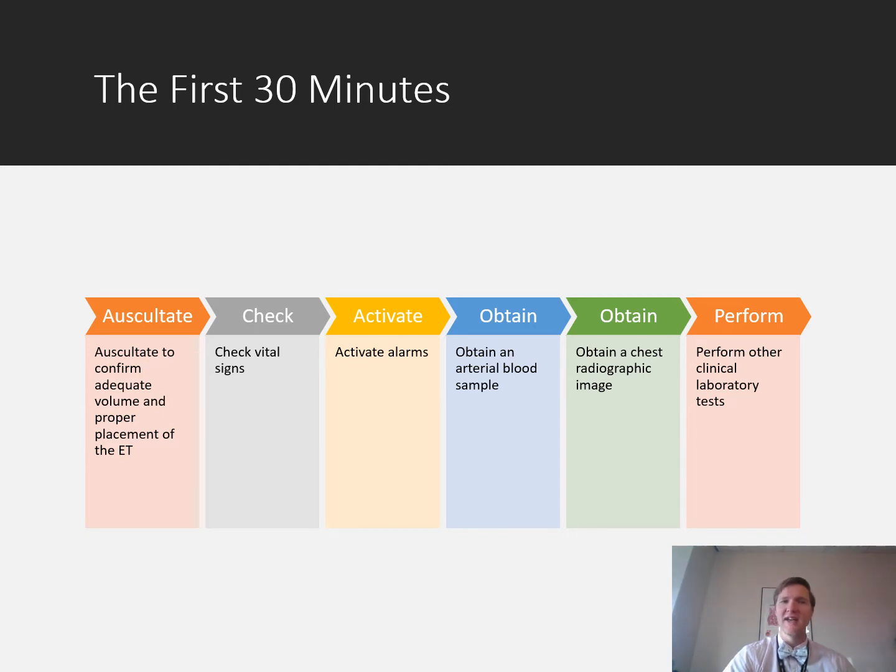So heart rate and blood pressure, because ventilation could easily impact those as well. If I give too much PEEP, if I give too much mean airway pressure, if I give too big of volumes, can they impact blood pressure negatively? Absolutely, they can decrease blood pressure and cause low perfusion to organs and low perfusion to the brain as well with vena cava restriction. So we got to look at that.